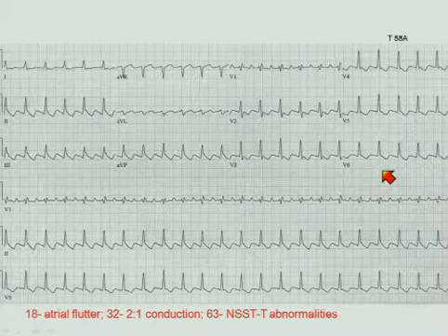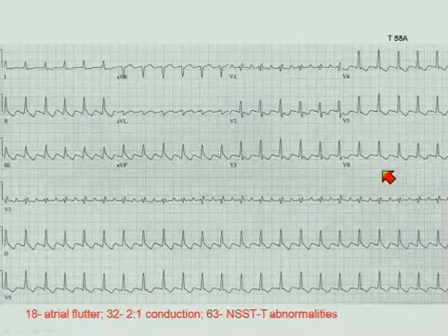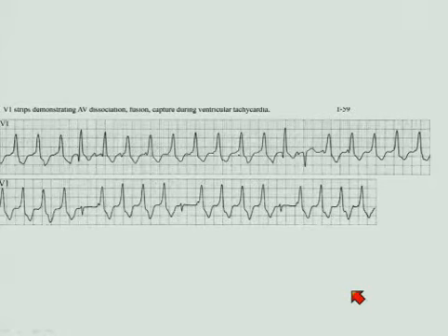All right, just a few words about ventricular tachycardia from an electrocardiographer's standpoint. There are 2 main ways we identify VT. One way is to look for the relationship of the atria to the ventricles. That is to say, is there AV dissociation, fusions, and captures? And since we don't often see that on the electrocardiogram because the P waves may be buried in the tachycardia or there may be other forms of interference, we have to rely on a set of morphologies, appearances of the QRS complexes that just by experience and looking at a lot of electrocardiograms we know are more likely to be VT or more likely to be SVT.